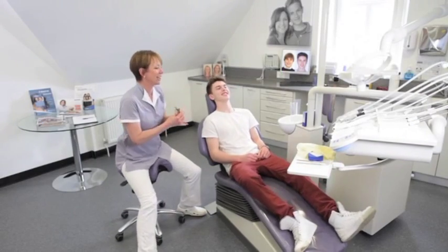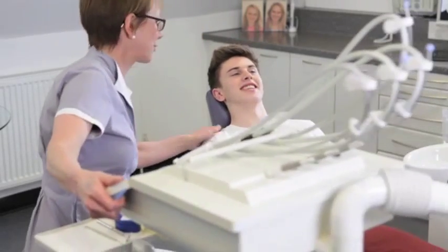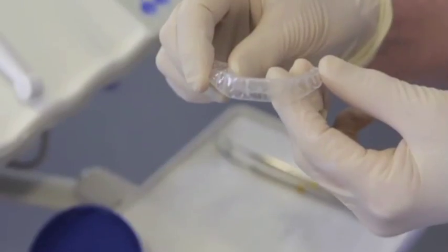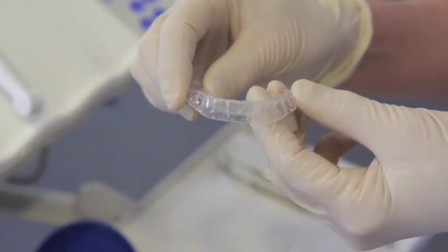Now you've got your lovely smile and teeth, it's important we make sure you keep them like that forever. We make a mould of your teeth which our technician Ben will then turn into retainers.